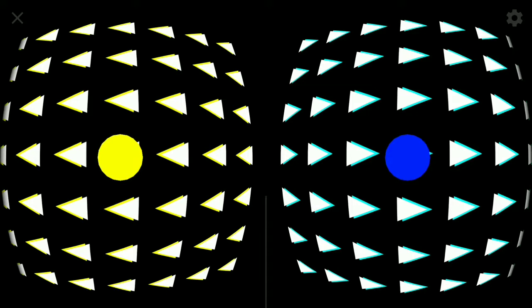So press the right arrow key, so the letter D, to increase the number of hertz. So this is 1 hertz. And try to fix with your right eye, and then left eye, right eye, left eye, and keep increasing the hertz. 3 hertz. See how fast you can go. Try to train yourself, even if it makes you feel uncomfortable, yeah?